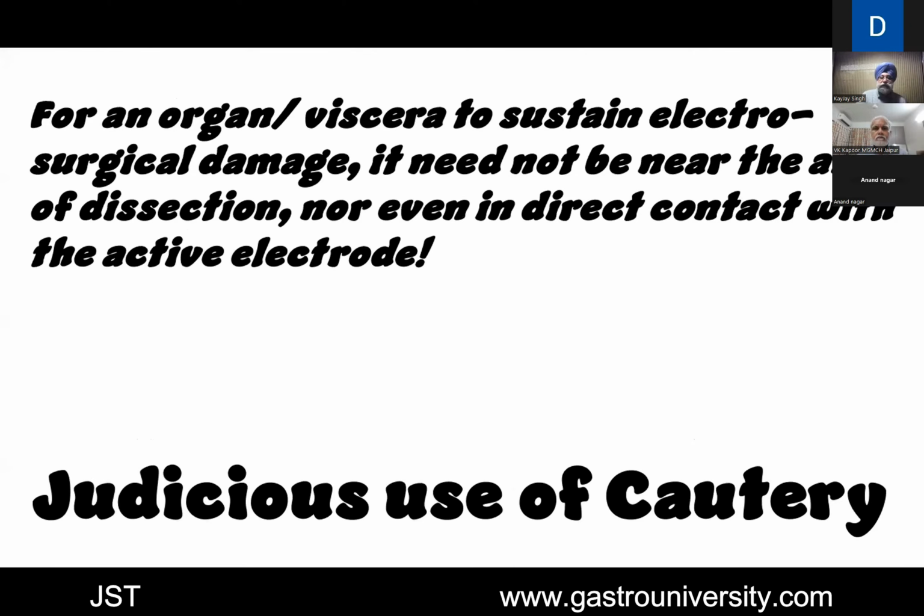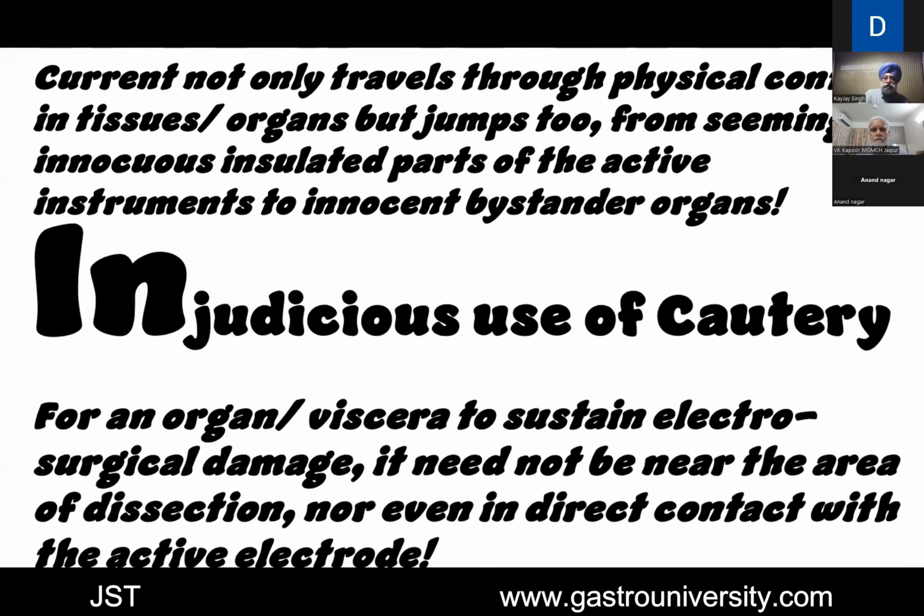So in this background, can cautery usage ever be judicious? I would rather say cautery is a dangerous weapon, and it can only be used injudiciously, howsoever smart or careful you are. How? Let's come to that.